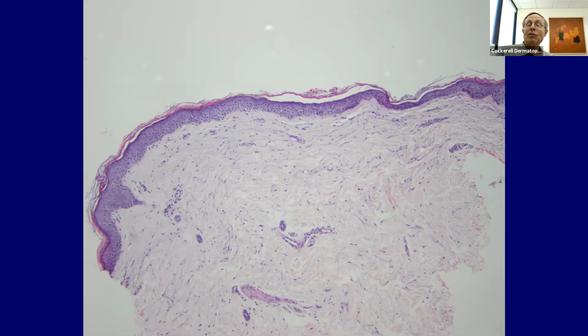Okay, punch biopsy, very, very sparse infiltrate. So what do you do when somebody throws a biopsy in front of you that's got basically nothing on it? Okay, you have a normal skin differential diagnosis. So you have a systematic approach. I don't care how you do it, but I usually like to look in the dermis, say, well, there's really minimal inflammation here. You look, see if there are any cells in the dermis. Is it mainly a vascular process?